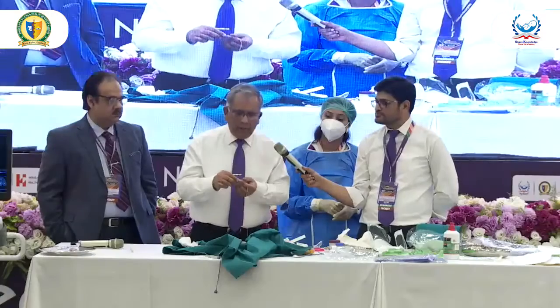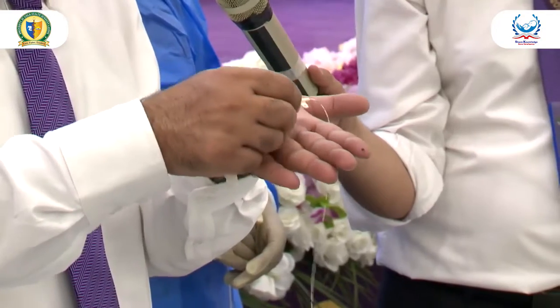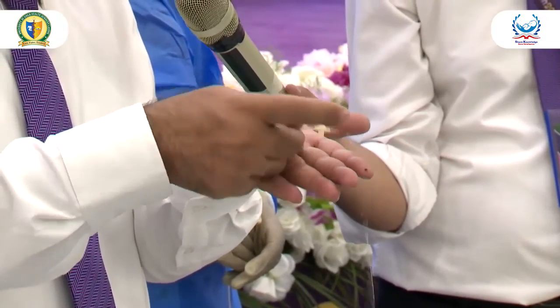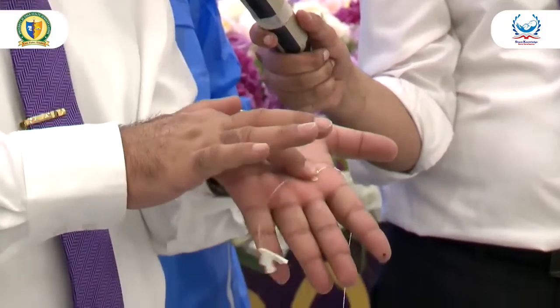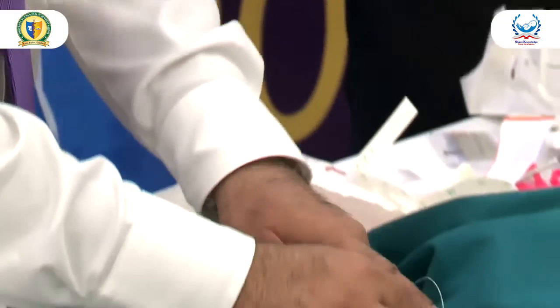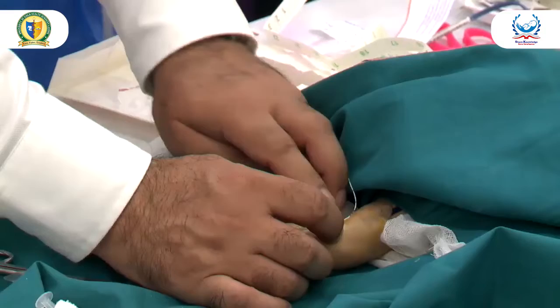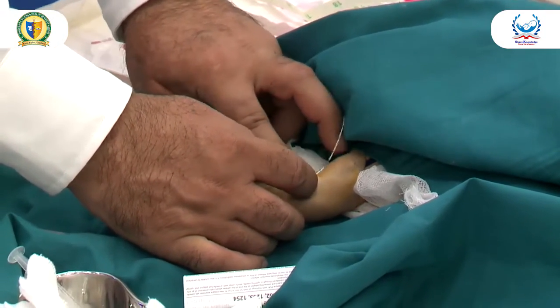Or some of the manufacturers, this is a butterfly. They have a special receptacle for butterfly, which is on one side is sticking, and you can just put like this, कड़क करके वो उसके अंदर, वो इस जगह के ऊपर यूं आप कड़क करके उसको फिक्स करते हैं इसके साथ ना. You can do it. So मुख्तलिफ चीजें आती हैं fixation के लिए.